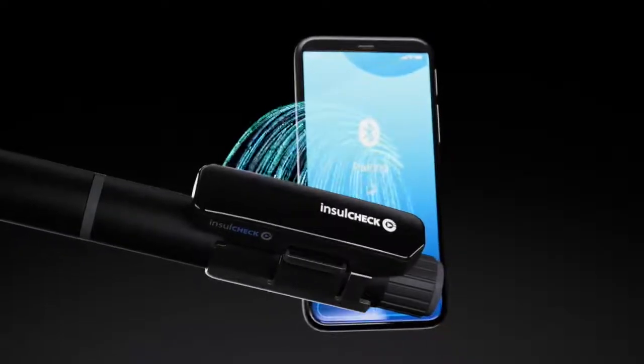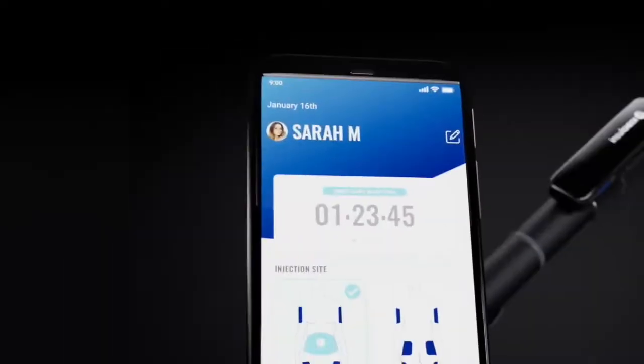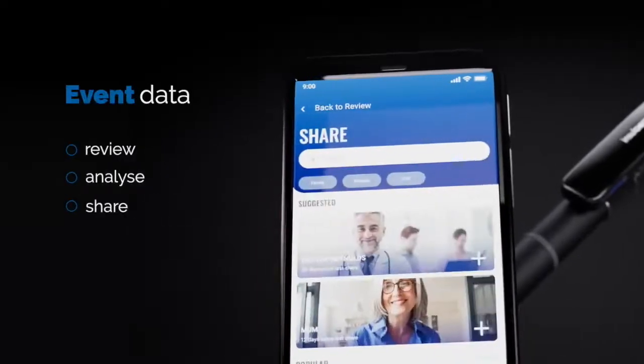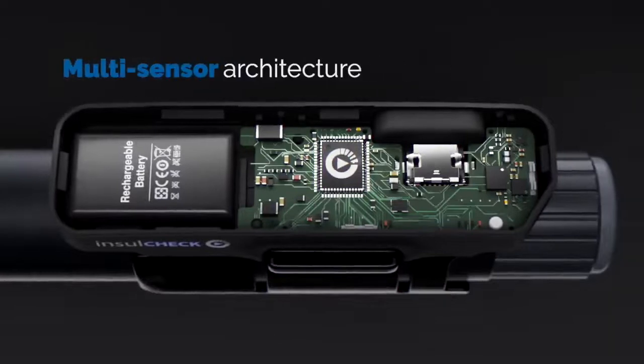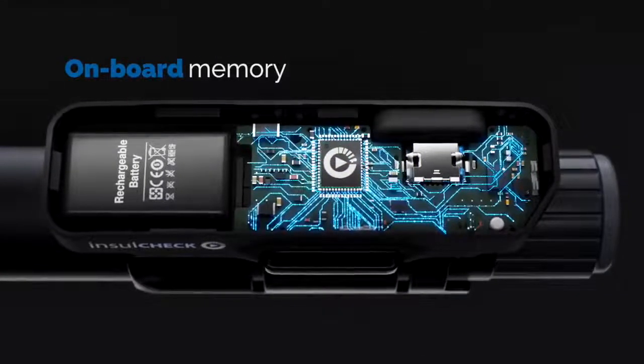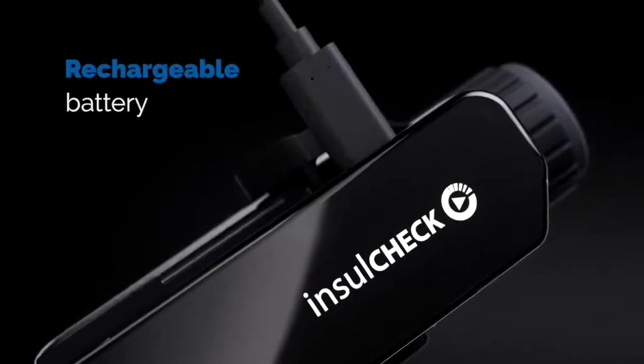The power of InsulCheckDose is unleashed when connected to a diabetes management app where event data can be reviewed, analyzed and shared. InsulCheckDose utilizes a multi-sensor architecture and features onboard memory and a rechargeable battery.